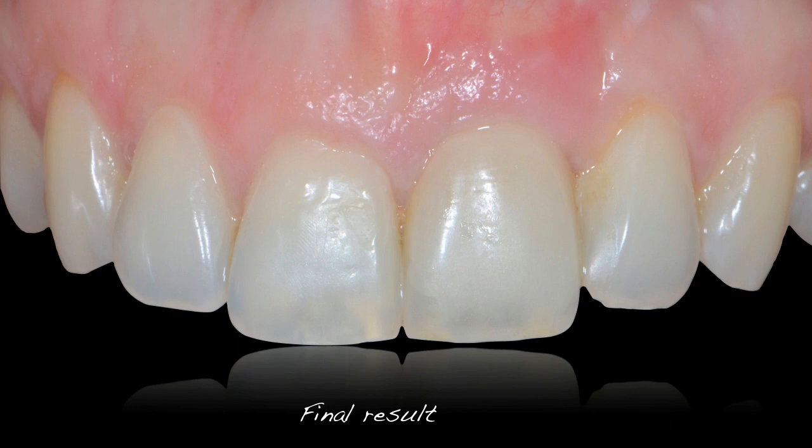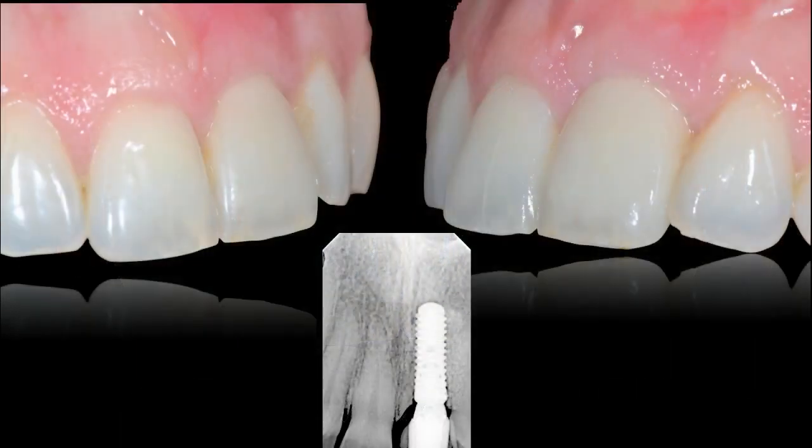This is a side shot of the same final result with a great tissue blend, a great adaptation of the papillas, and the color. Both pink and white aesthetic scores are great in this case. And the radiograph showing perfect integration of the implant and a perfect emergence of the crown.